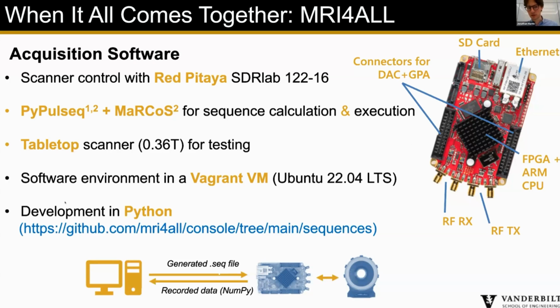And then all the development for this console, for this acquisition software, all happened in Python. And you can find all the GitHub code for that at this link.